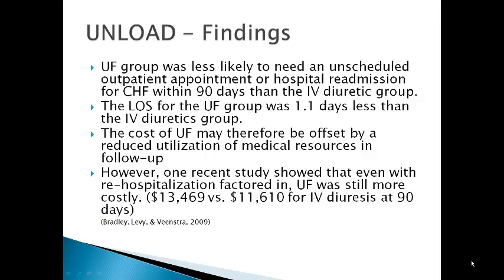The length of stay for the ultrafiltration group was 1.1 days less than the IV group. The cost of UF may therefore be offset by a reduced utilization of medical resources in follow-up. However, one recent study showed that even with rehospitalization factored in, UF was still more costly.